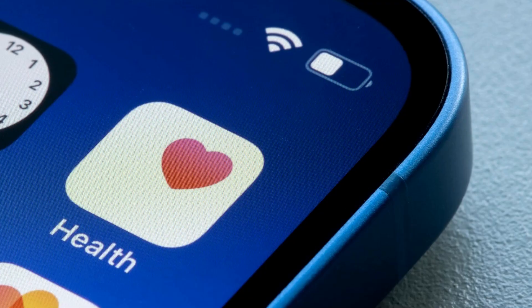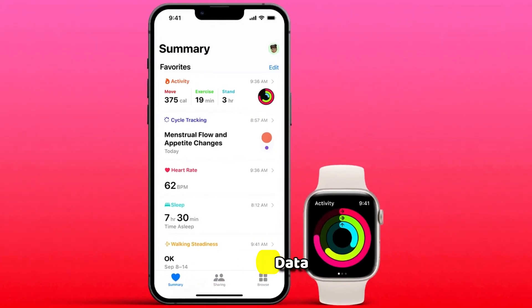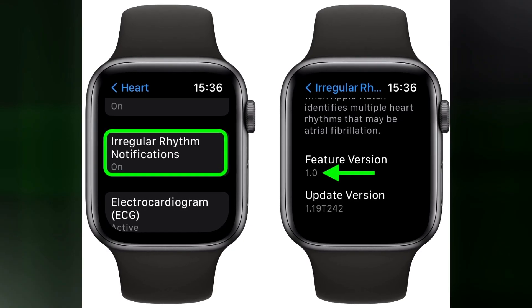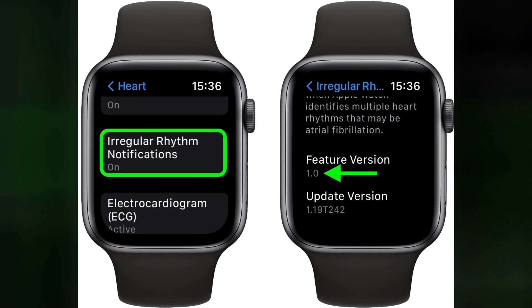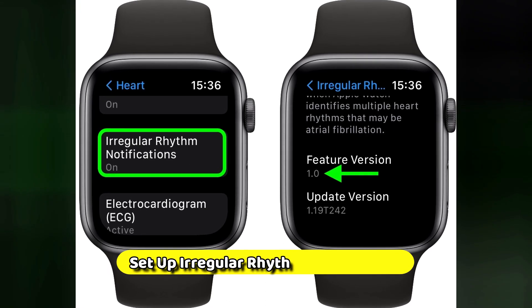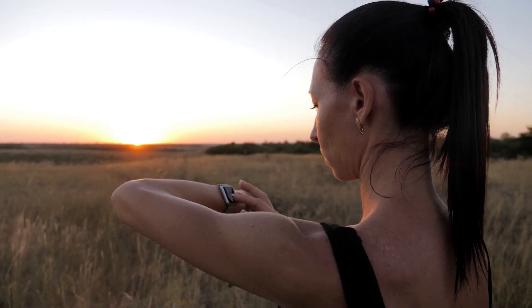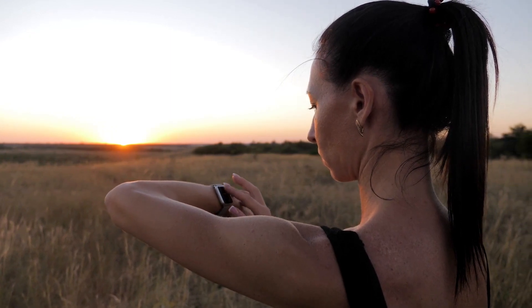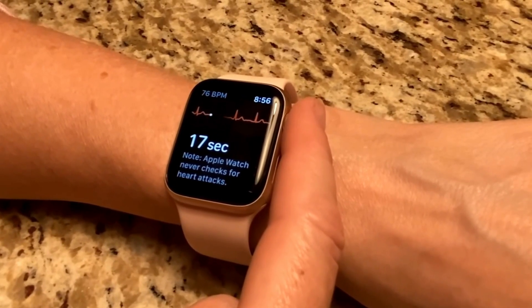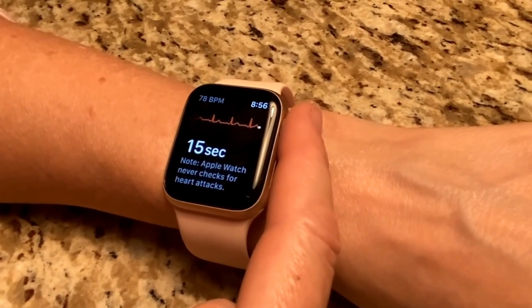On your iPhone's Health app, go to Health Data and select Heart. Tap Electrocardiograms (ECG) and choose Set Up Irregular Rhythm Notifications. Follow the prompts to enable notifications for irregular heart rhythms. This allows your Apple Watch to monitor your heart and notify you of any irregularities.